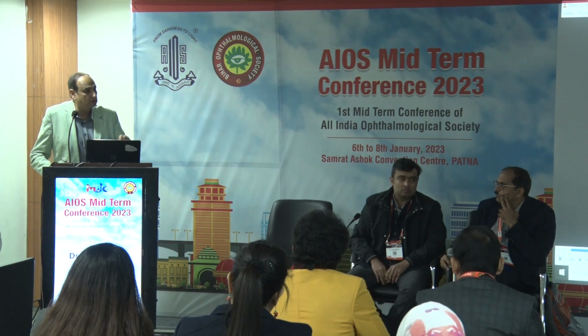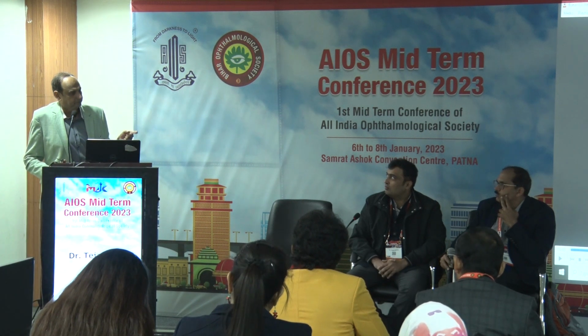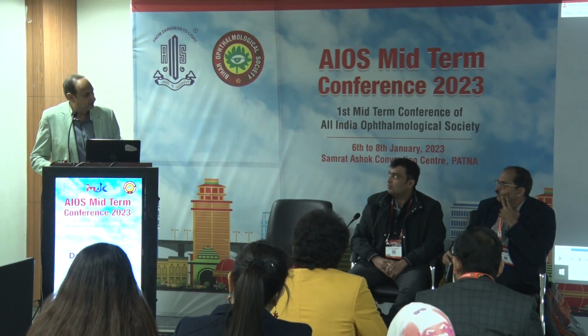This also was not a central flow. So the most important reason for explantation was cataract, and one for Urrets-Zavalia syndrome. Otherwise, we have been very happy with our sizing, and twice we did not actually explant, but we reoriented the phakic IOL to make it more suitable inside the eye.